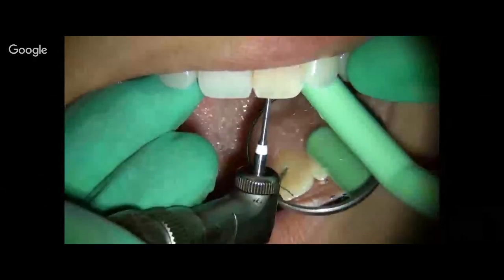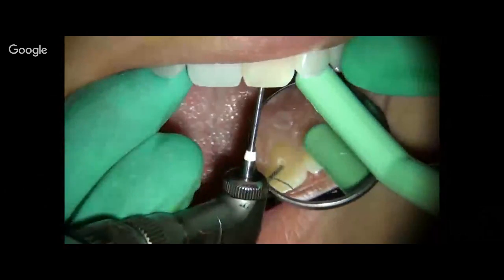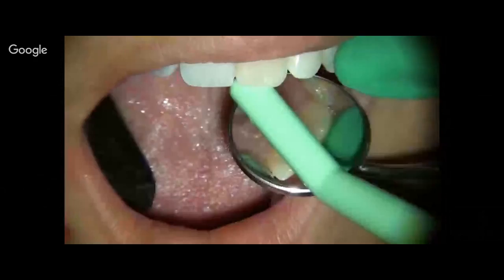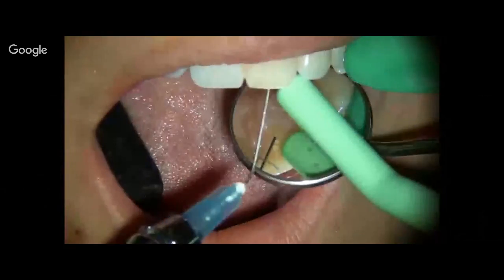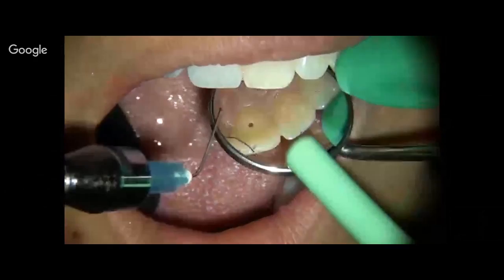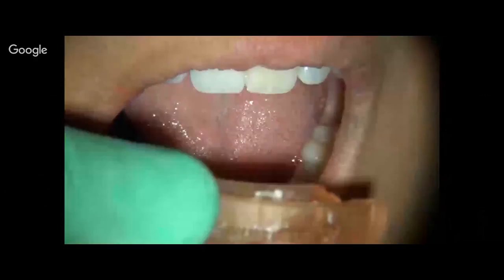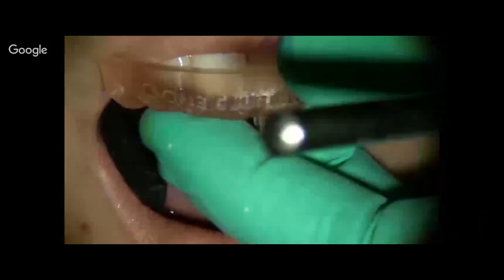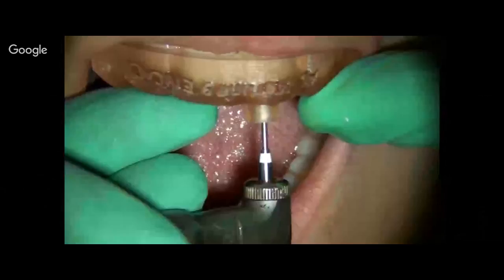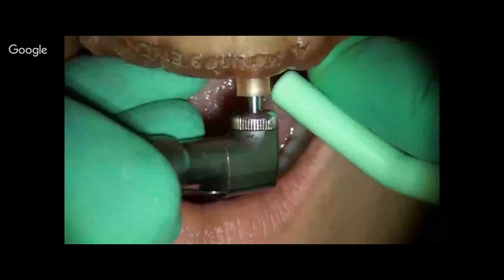I'm clearing the dentin chips, opening it up a little bit. I'm sorry for the scratch on my mirror, but you can see all the way to the bottom of the drilling path. Replace the guide again, and then you can go in as deep as it would allow you. And normally with the long drills, you would see here, right here, that dip, that was me popping into the canal.